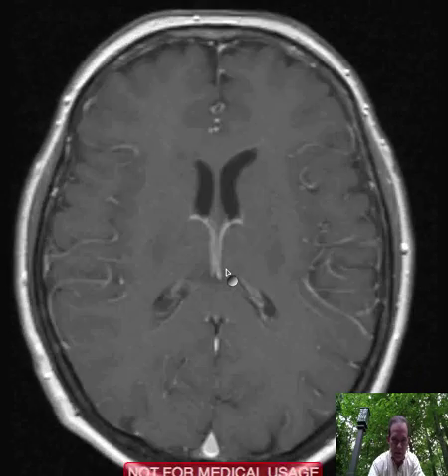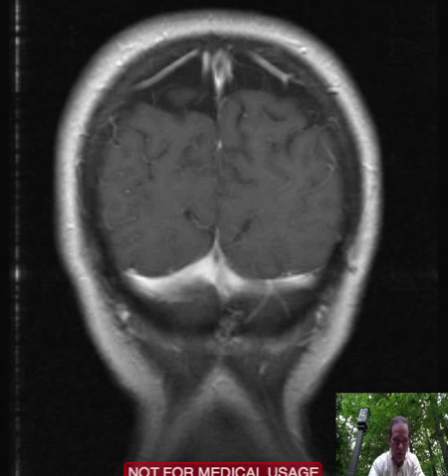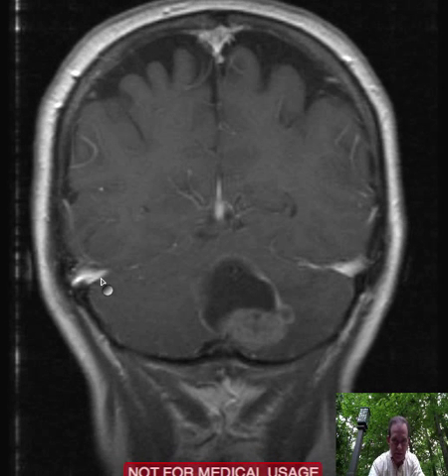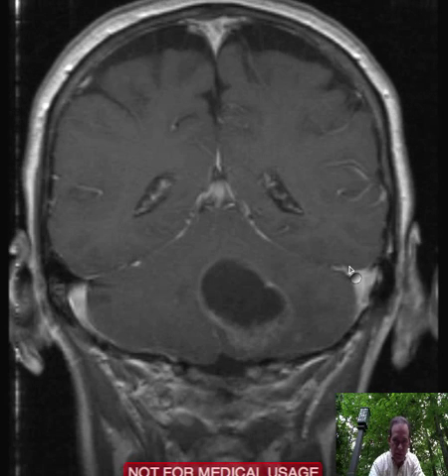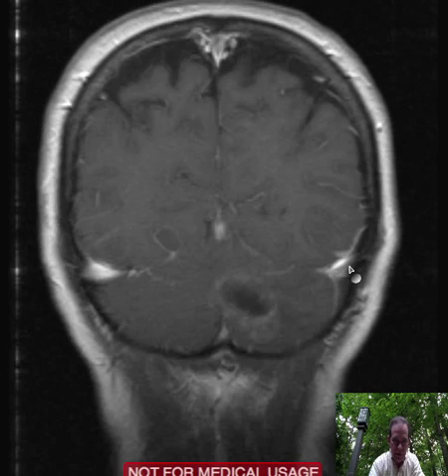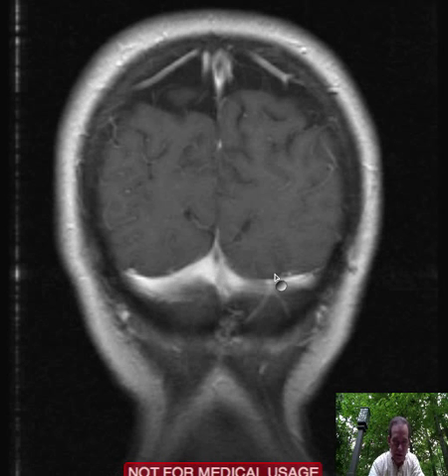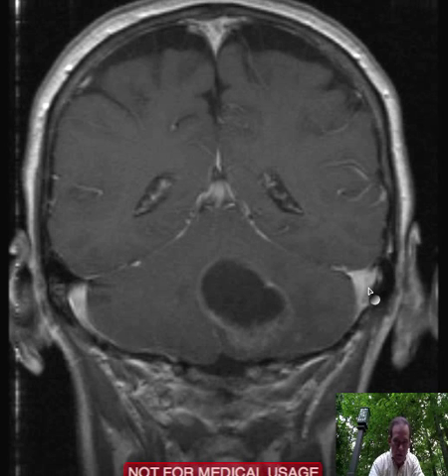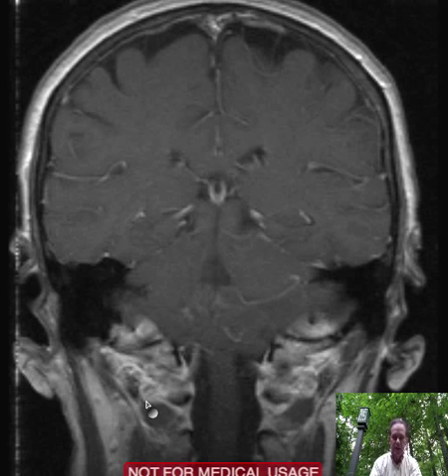Let's see what IV contrast does for this hemangioblastoma. It enhances the mural nodule, and it can be very intense enhancement — in this case it is not. Here are the venous sinuses in the posterior fossa, and if we follow them back, we see that the sagittal sinus comes down and joins the two transverse sinuses, and they in turn drain forward and inferior to give rise to the jugular veins at the skull base.